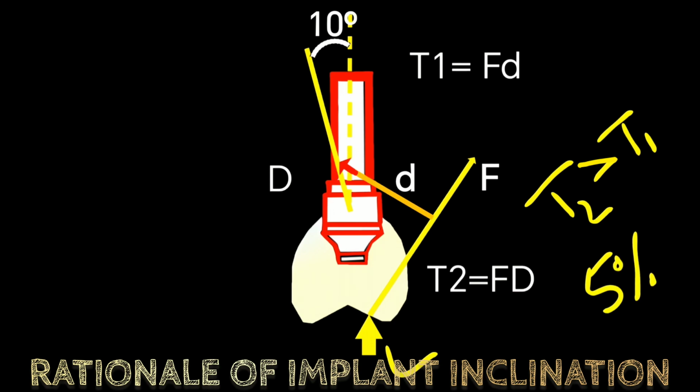Altering the implant body's orientation relative to the occlusal load changes the working arm, creating a lever effect that intensifies the resultant force. Think of it as a lever. The farther the force moves away from the center of rotation of the implant body, the more leverage is exerted against the bone implant interface.